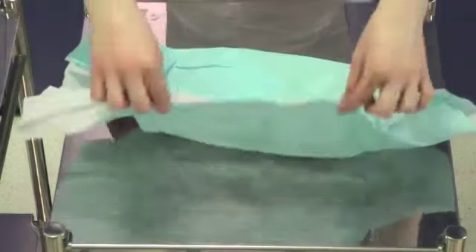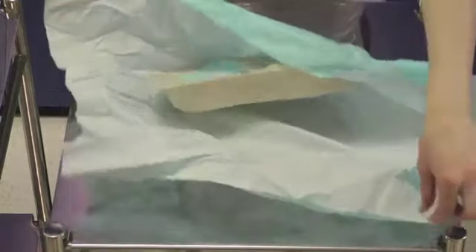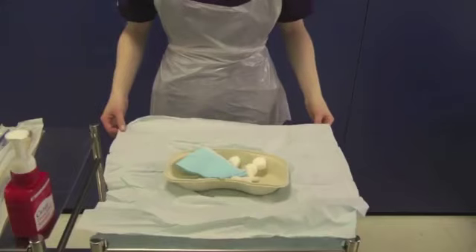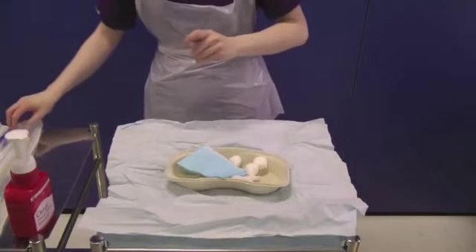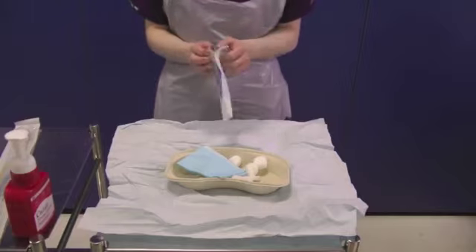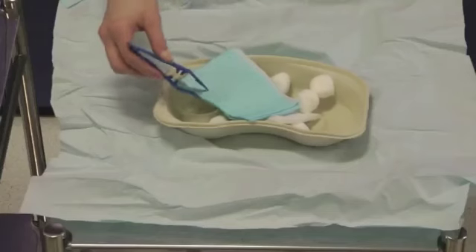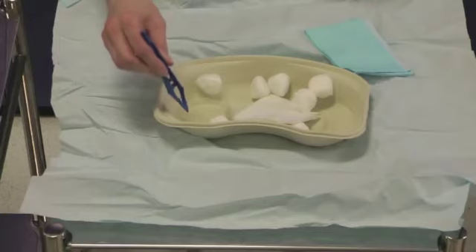You should open the pack away from you first of all. Take your sterile forceps and organise the contents of the catheter pack, placing the cotton wool balls into the sterile pot.